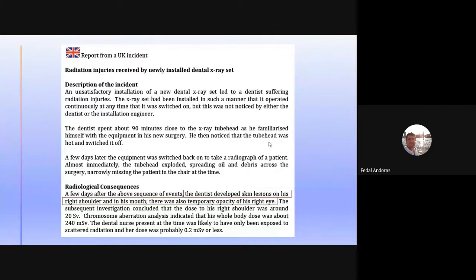So whenever I stand, in the next lecture I will talk about the radiation protection for operator. I was always standing in the safe area, but unfortunately, this safe area wasn't safe for me because there was leakage. Unfortunately, it was a digital X-ray, and I received enough X-ray radiation, but not exceeding the annual limit. But it was too high for that time. Okay, so these things can happen.